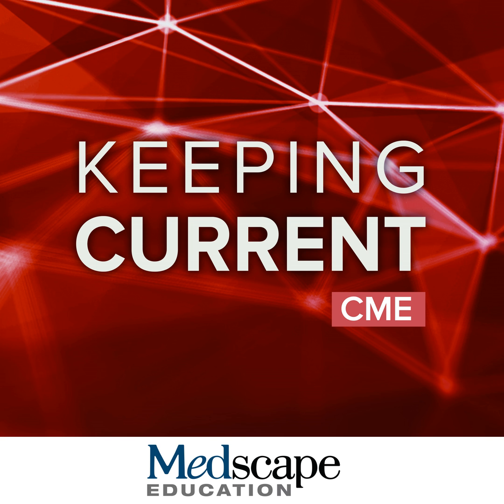The take-home point from these cases is that other processes may have similar imaging findings of ARIA, and the clinical history is key in the differential diagnosis. And specifically, is this patient on an amyloid targeting therapy? In summary, ARIA are imaging abnormalities of edema and hemorrhage that occur in the setting of amyloid targeting therapies.